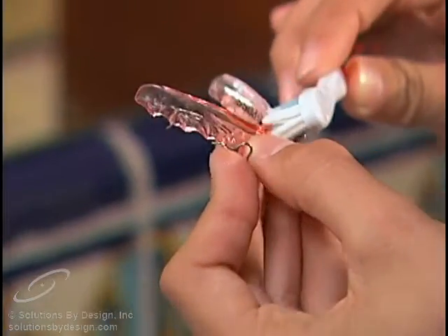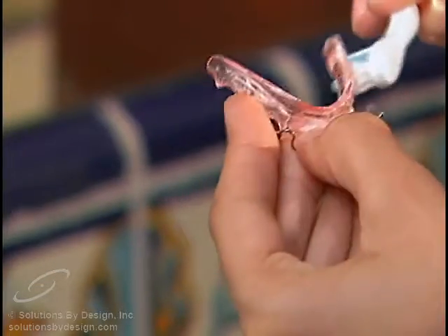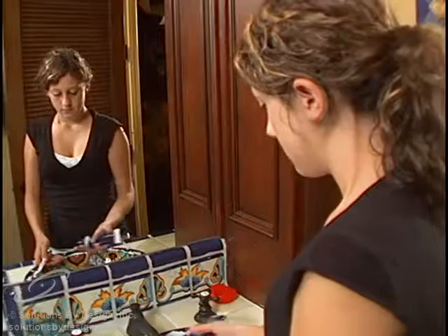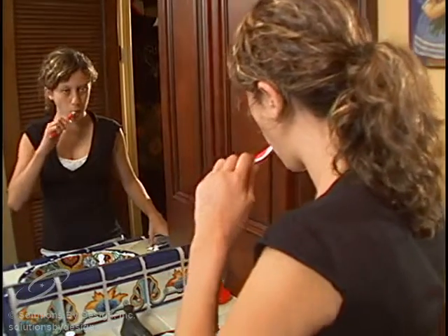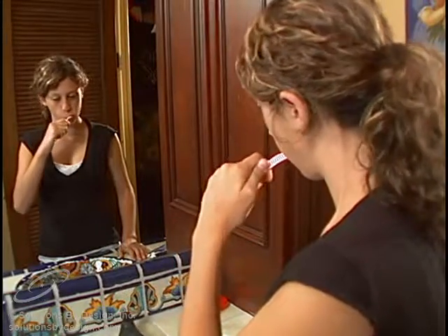Your retainers should be cleaned after each meal and before going to bed. Retainers can be cleaned with your regular toothbrush and toothpaste. Before placing the cleaned retainers in your mouth, be sure you thoroughly brush your teeth. If the retainer or your teeth are not kept clean, an irritation of the gums may result, and this can be serious.